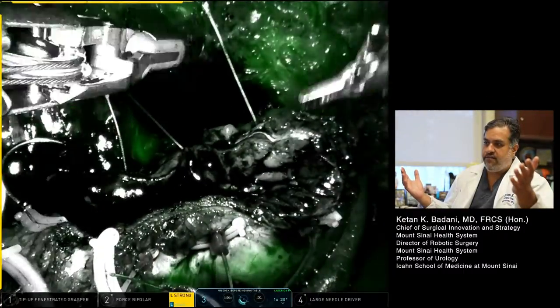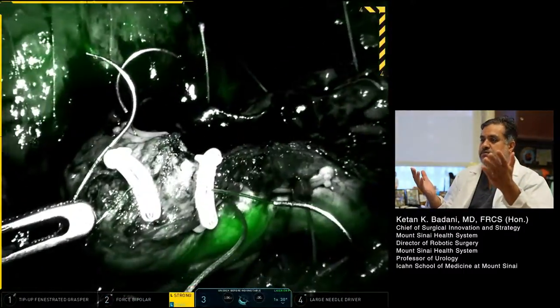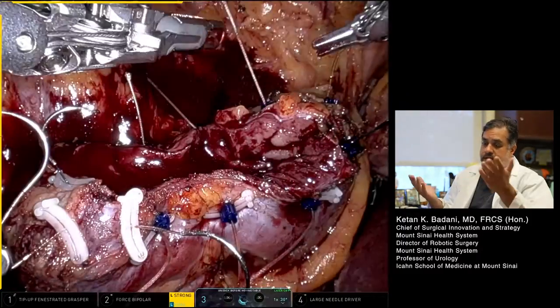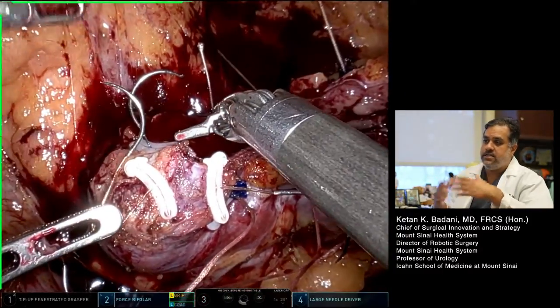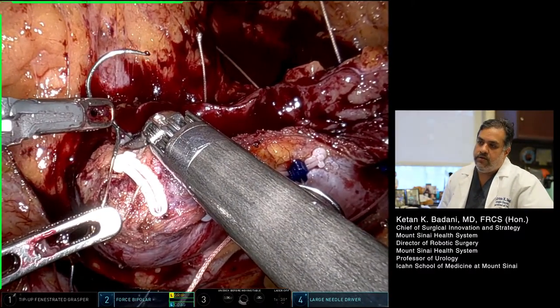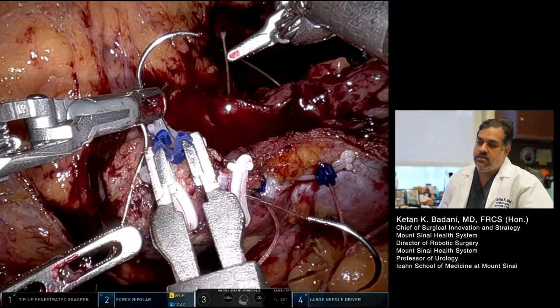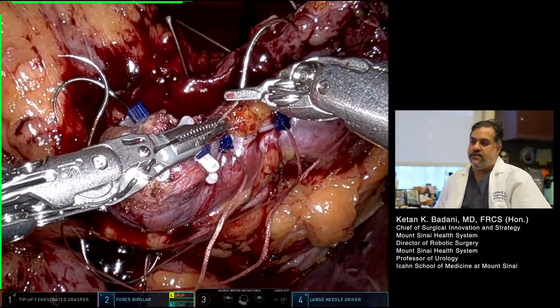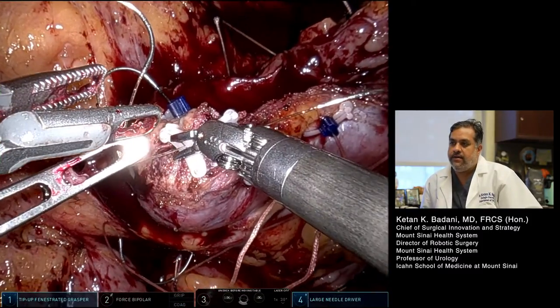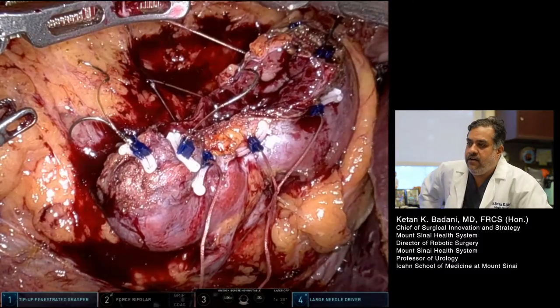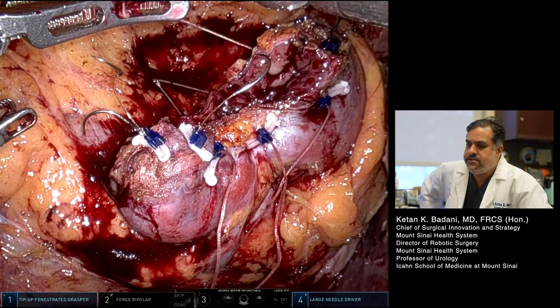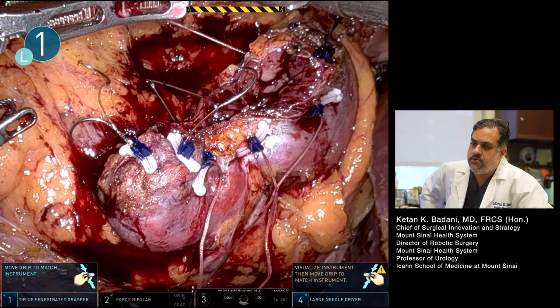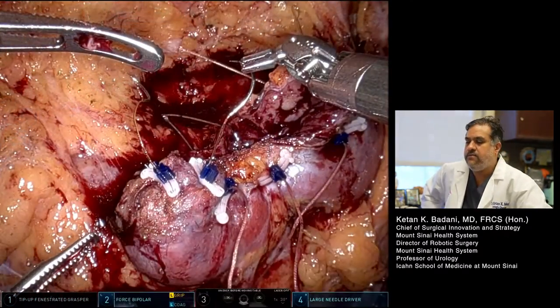This is endocyanine green — the firefly view — and I want to see if the rest of the kidney is perfused appropriately. I think this is a wonderful use of firefly because especially in these deeper tumors, sometimes you knock off branched renal arteries and an entire portion of the kidney can be ischemic. Although we don't necessarily act on that, it's good to know ahead of time. Here you see good perfusion of the remaining cortex and kidney. I'll finish my lapra-tie clips — renorrhaphy is finished. The warm ischemia time on this was very reasonable, in the low teens. Watch it for a few minutes, make sure nothing is bleeding, then start cutting the needles out and removing them.